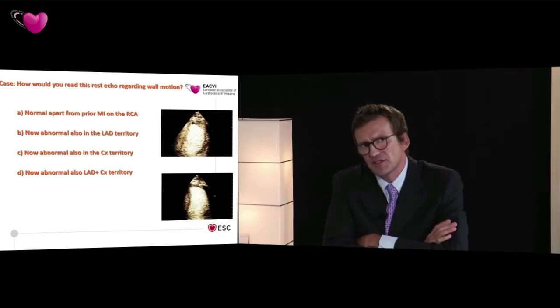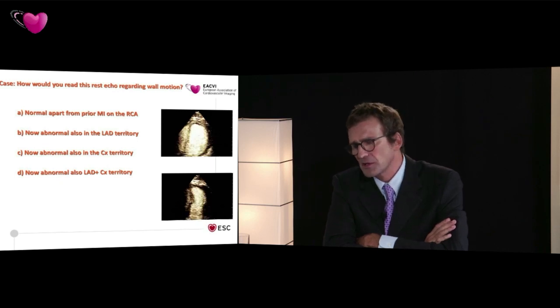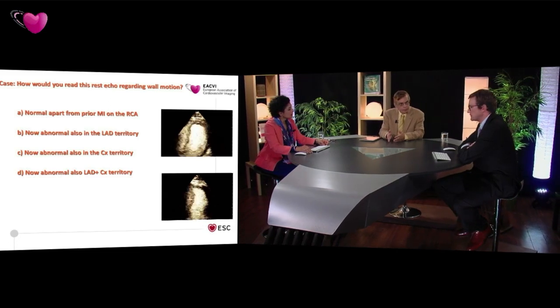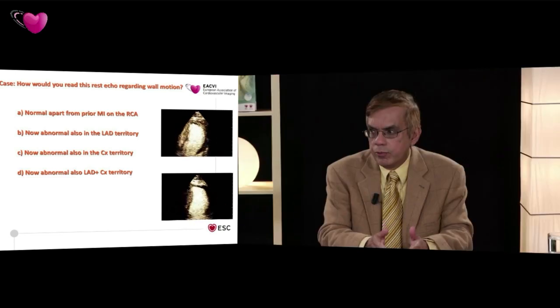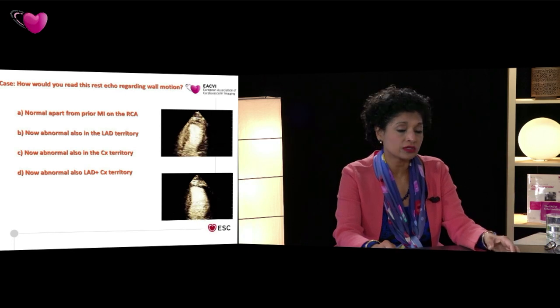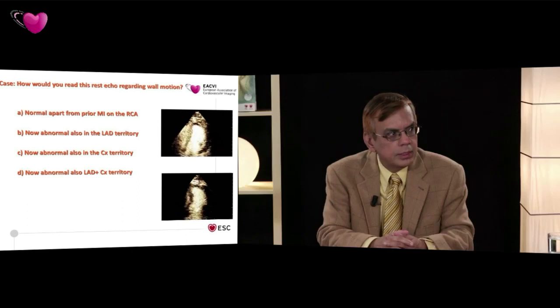But if something is wrong with your clinical judgment and the patient has some type of symptom which is not very clear, then you should use it, because you can uncover something that you couldn't see, even with perfect images. If you're suspecting coronary artery disease in that patient, then you must see the whole of the heart in a perfect way. You cannot foreshorten the apex because that's where the abnormalities mostly occur. Yeah, and this is where clinical management is going to be dependent. Class 1A recommendation for giving contrast. I think we can't stress that enough. Yes, and if you've seen the cases, it is really important to do that.